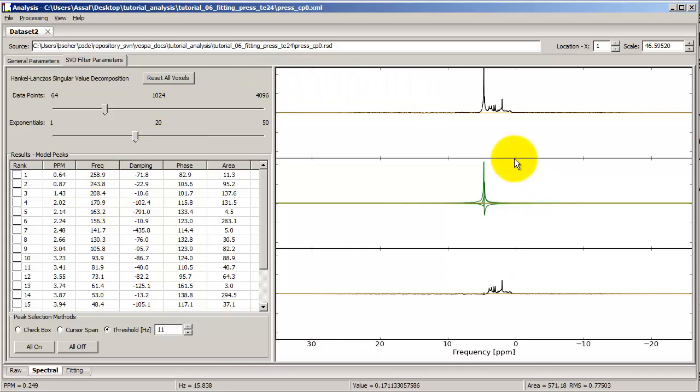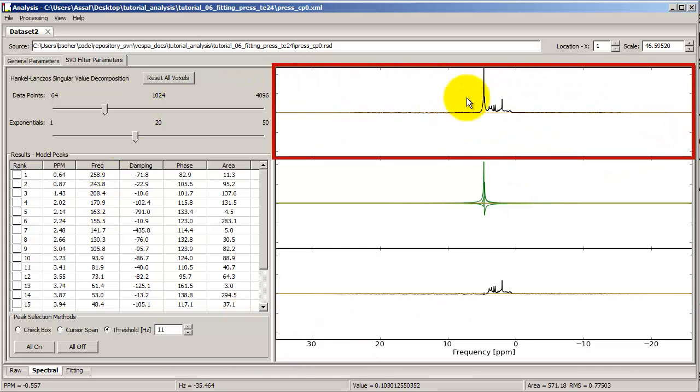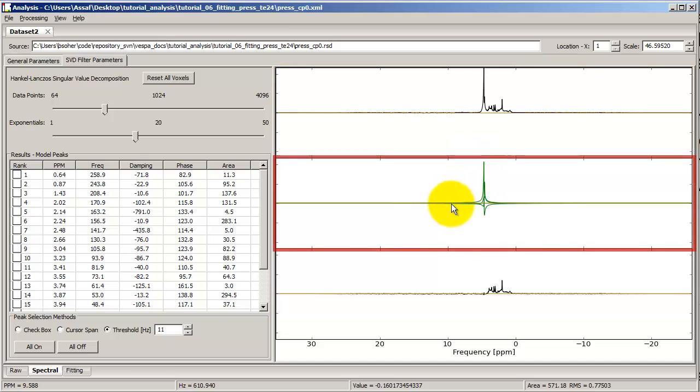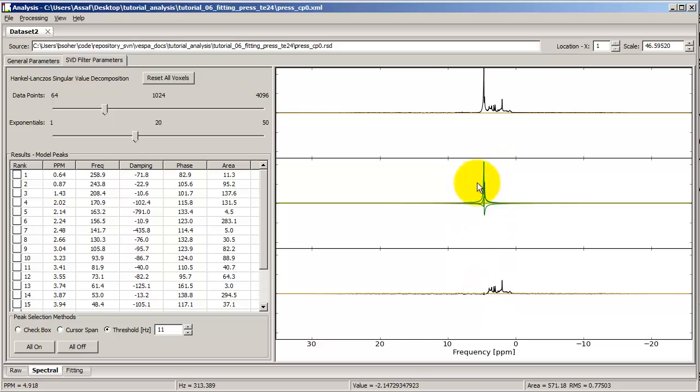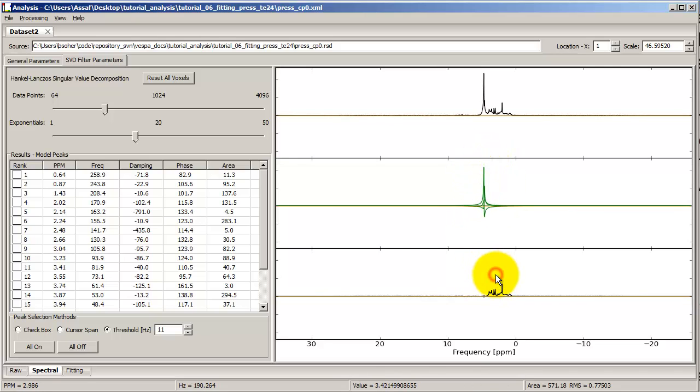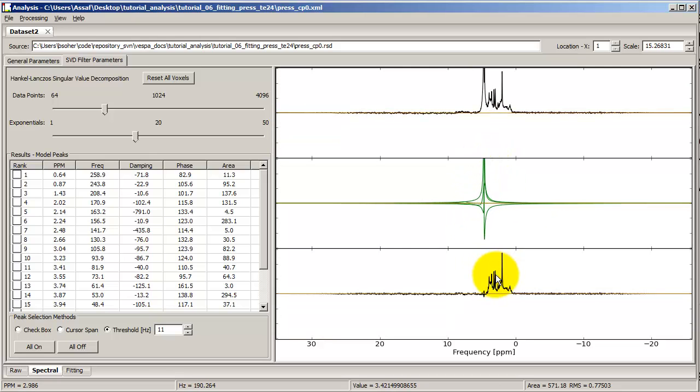So here's the SVD view. On the top here, we have the original spectrum. On the middle spectrum here, we see the peaks that the SVD filter recognizes and that we choose to include. And the bottom spectrum shows the difference between the top and the middle. So what we've actually done is we've taken out these peaks identified by the SVD filter. So first of all, I'm going to zoom in a bit, just so you can see better.